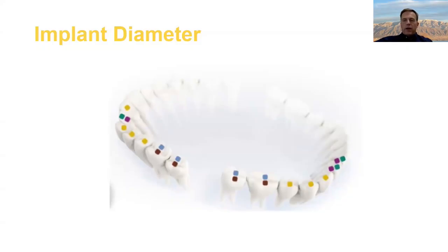So let's think about our bone to implant interface. If you see an implant fail, it almost always fails between the bone and the implant. So what we want to do is unload that area as much as we can. If we say that at every tooth position, the maximum occlusal force is a fixed number, let's say it's 100. Well, if I increase the implant diameter by 50%, I've cut down on the load per surface area at that critical implant to bone interface, and I've made a better situation for my patient, less likely to get failure from overload.